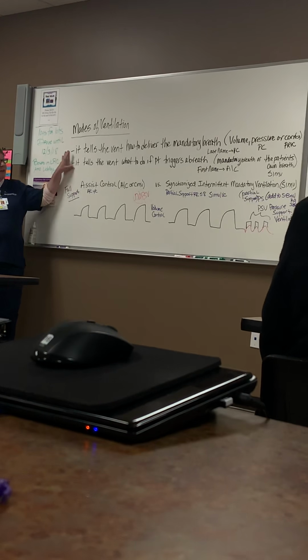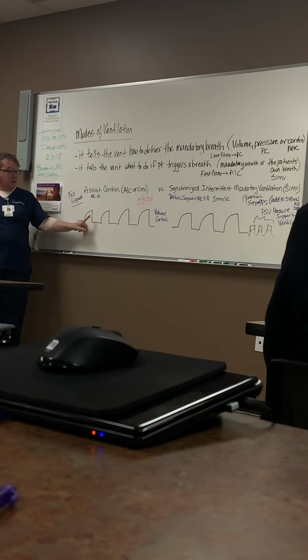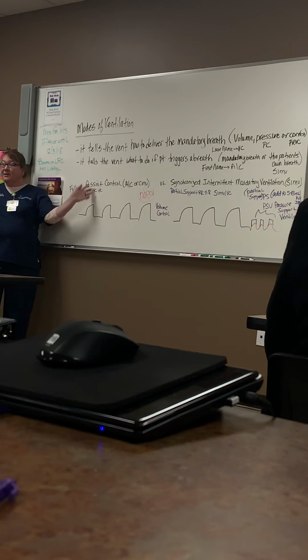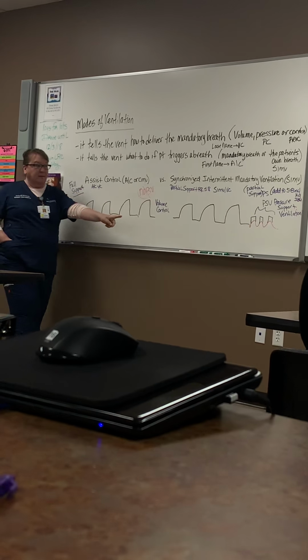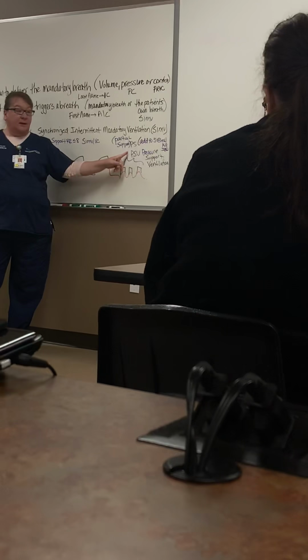And by my logic up here that I told you, the VC part tells the vent how to deliver the mandatory breath. So all of these mandatory breaths are gonna be volume based. And in SIMV, they're the same. The only difference between AC-VC and SIMV-VC is this: my patient can take the spontaneous breaths in between the mandatory breaths, and we can have pressure support.